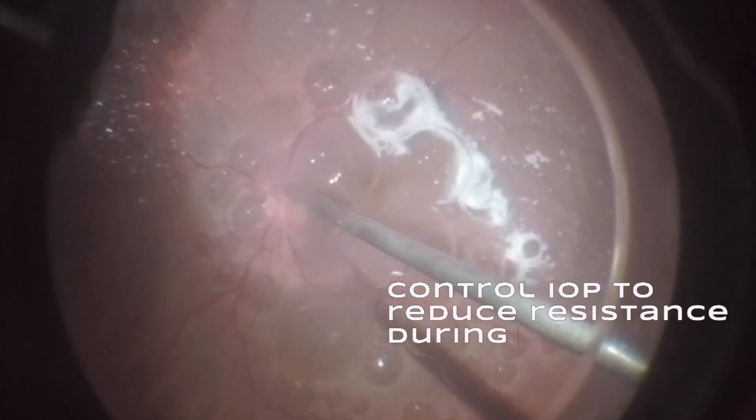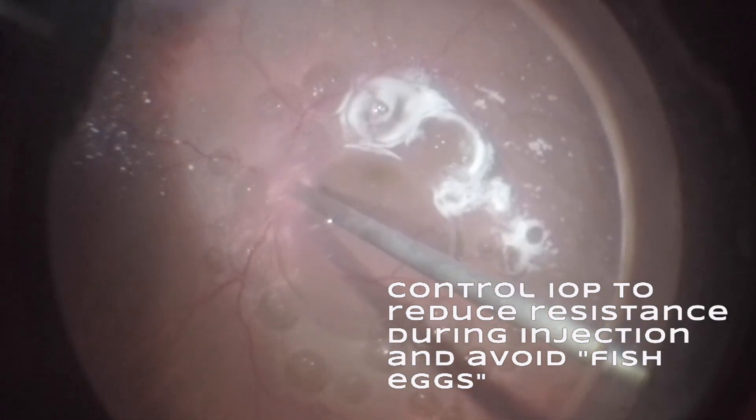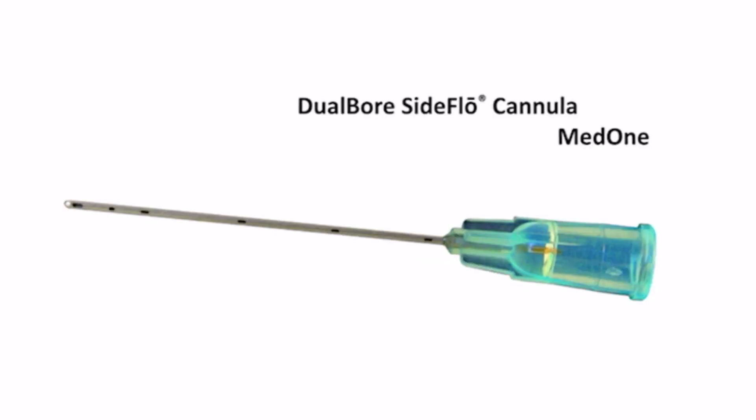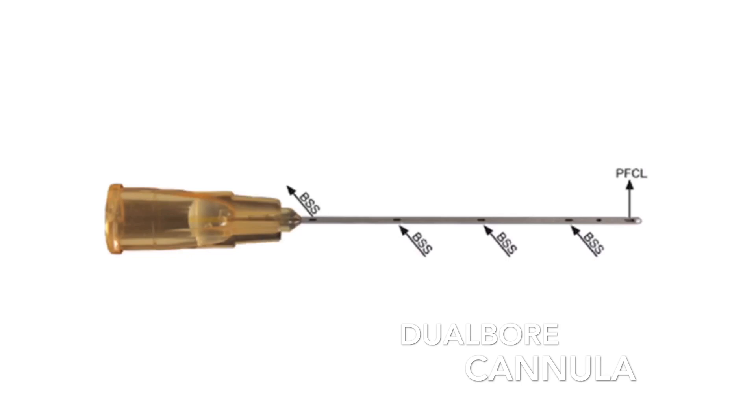Controlling intraocular pressure is crucial to reduce resistance during injection, and minimizing the formation of fish eggs can be achieved in various ways. To achieve low injection pressure and maintain stable IOP, dual-bore cannulas are highly effective.